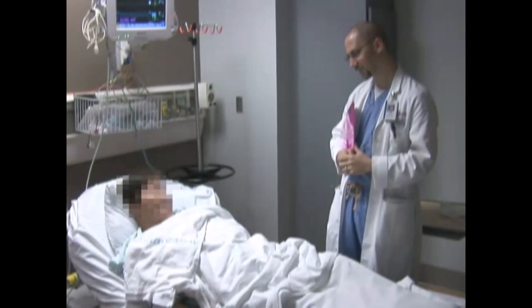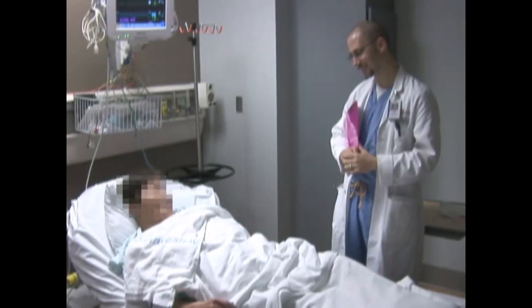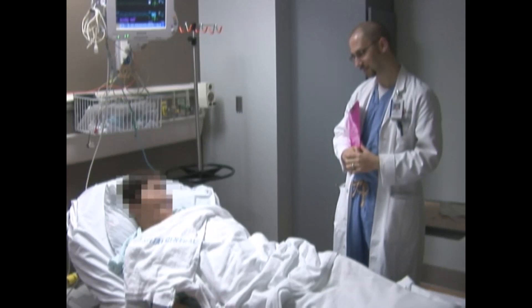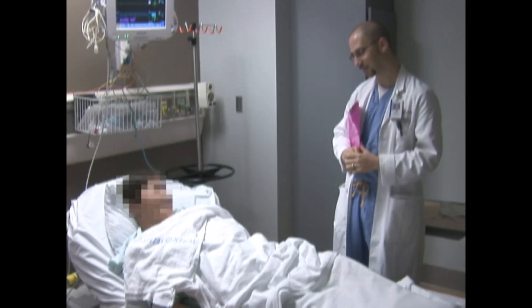Informed consent is obtained from the patient while discussing the plan for the procedure as well as the risks involved.